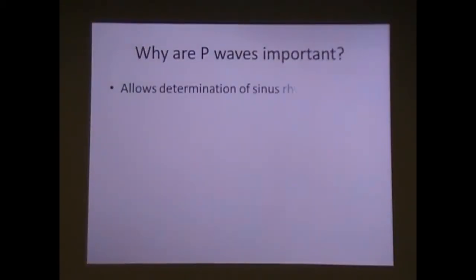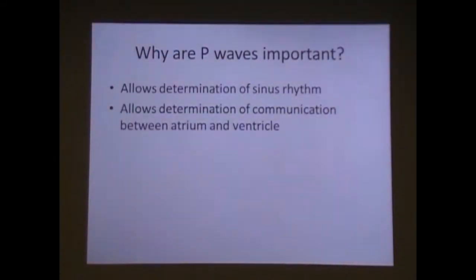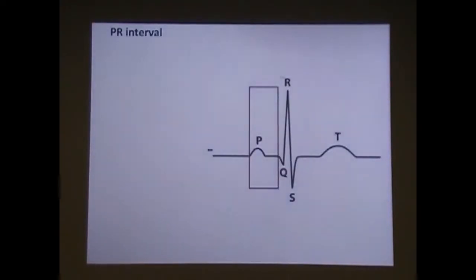Why are P waves important? Obviously, they allow us to determine sinus rhythm. They allow us to determine the communication between the top of the heart and the bottom of the heart. They help determine atrial enlargement. Okay, PR interval.